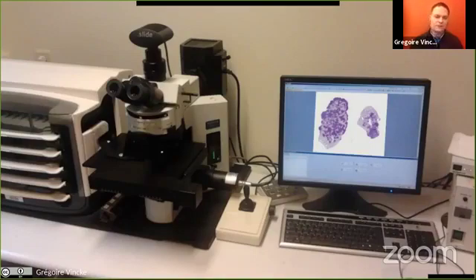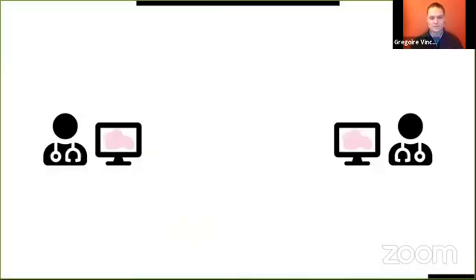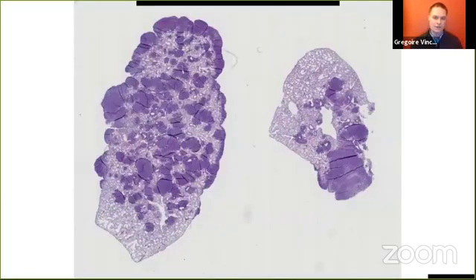Digitalization of pathology is very recent compared to medical imaging. Ten years ago, we saw the first robotic microscopes and then the fully automatic scanners to transform these samples into digital images. And the hope was very big to be able to share them, to work at the same time on the same sample and to enhance collaboration. But here is an example. These are two lungs of a mouse.